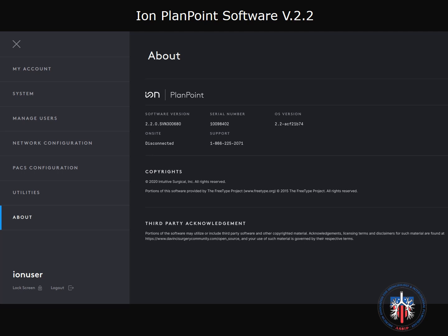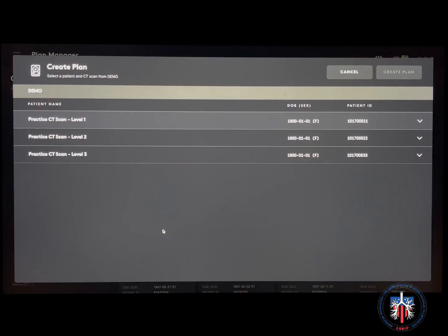We will be using the ION PlanPoint software version 2.2. Start by selecting the patient and import the chest CT scan data from PACS, or alternatively from a CD-ROM or USB flash drive.